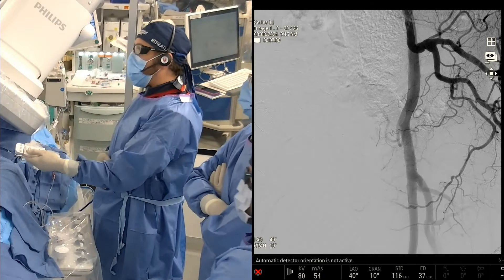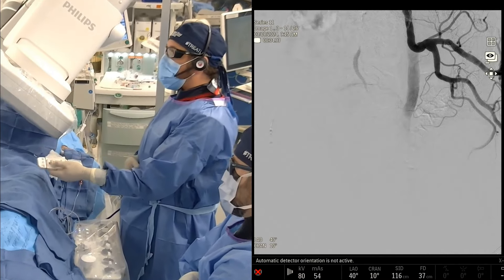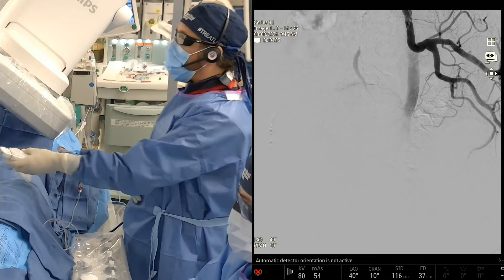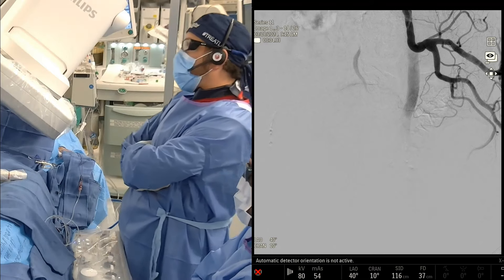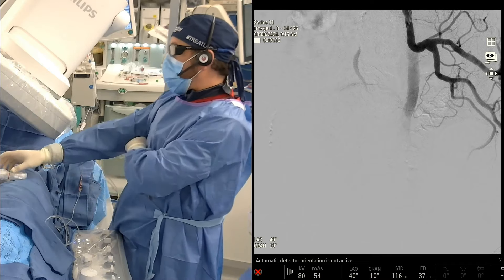What do you guys think of this angiogram? I'm going to go back to this image here. The first thing that we noticed — and we knew this from the CTA, which is another reason why the CTA is so valuable — is that we have no obturator artery here. Given that that's the case, it makes it a lot easier to visualize the anatomy.